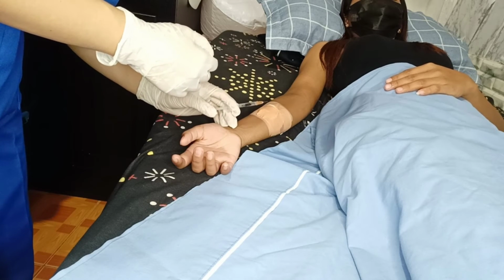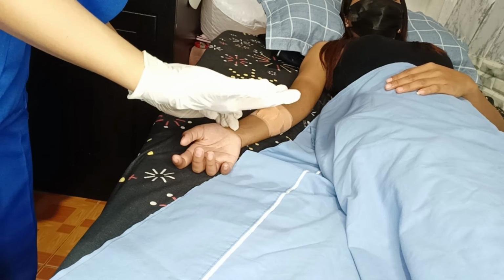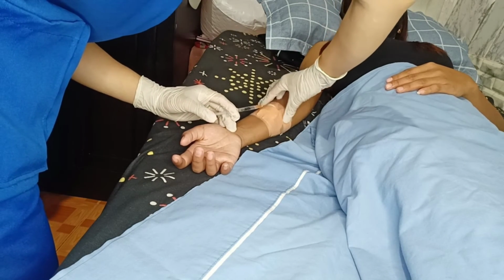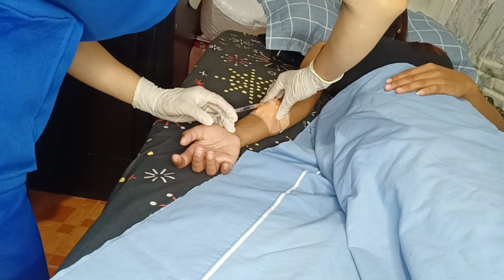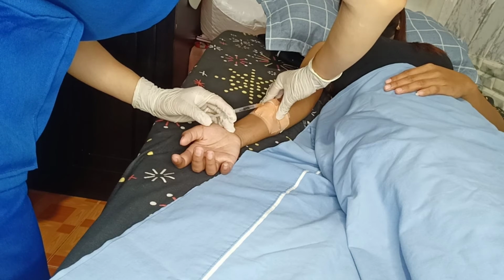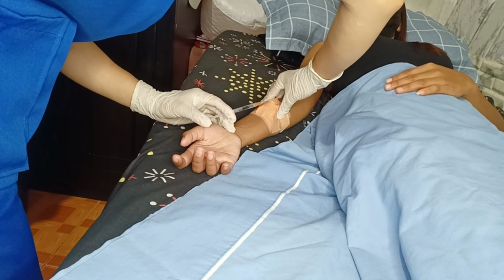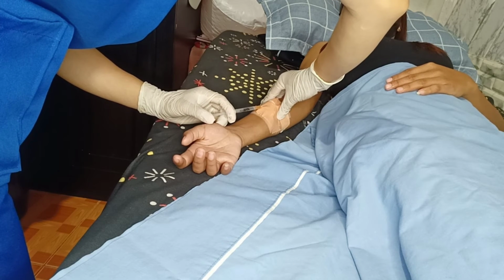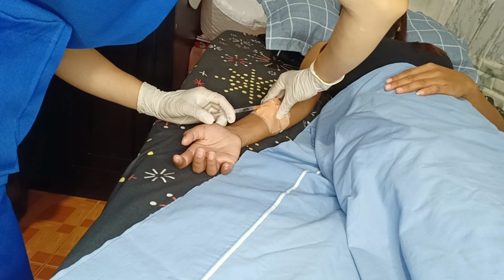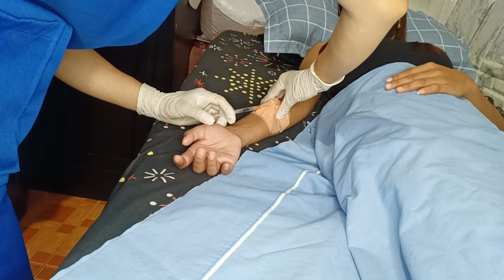Next, inject the fluid. With the non-dominant hand, pull the skin at the site until it is taut. Insert the tip of the needle far enough to place the bevel through the epidermis into the dermis at a 5 to 15 degree angle. The outline of the bevel should be visible under the skin surface. Stabilize the syringe and needle and inject the medication carefully and slowly so that it produces a small wheal on the skin.